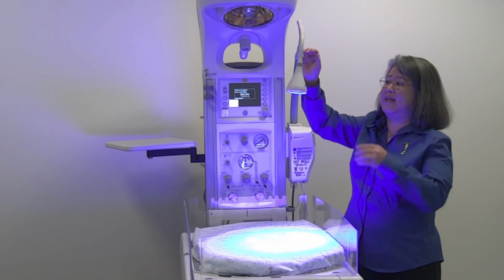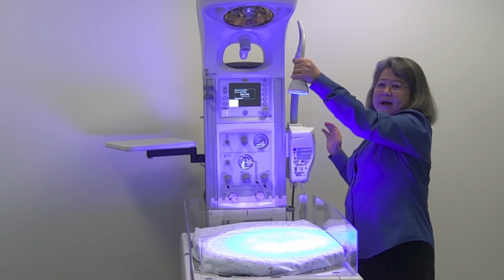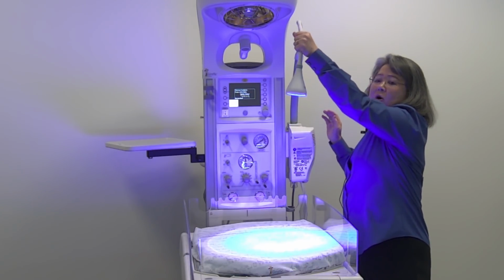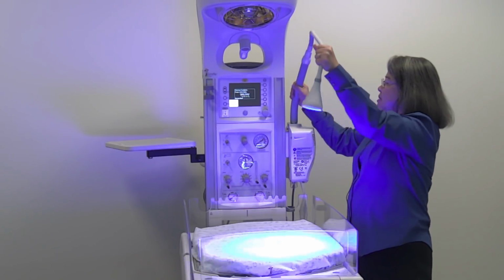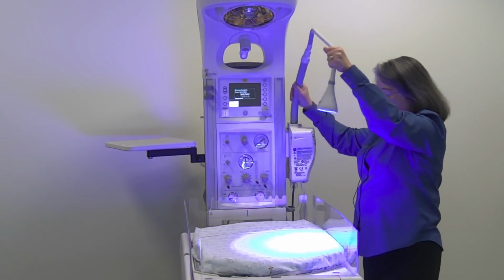One of the concerns we want to make sure you're cautious about is where the fibers are, and then here there's a lens and then the cone. So we don't want you to grab it right here to move it. We would like you to hold on to the light pipe and then use this neck to move it around this way, okay? So that's one point.